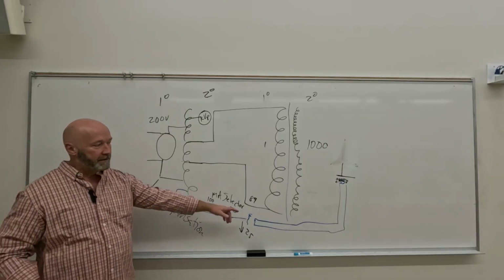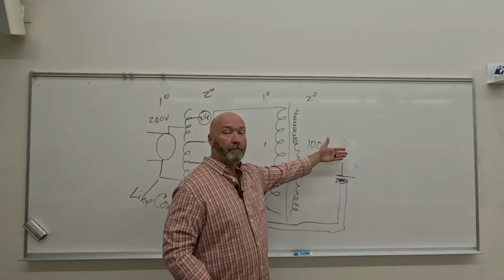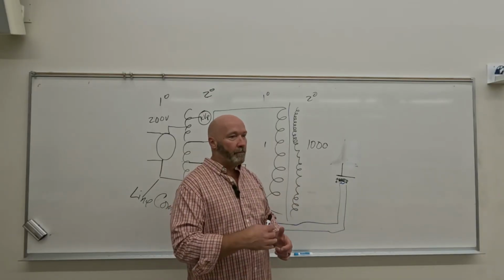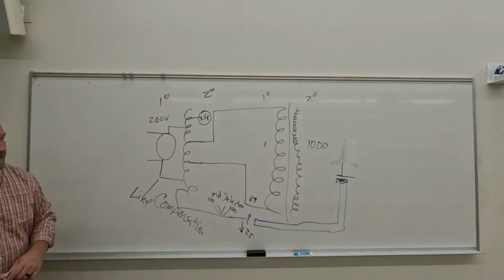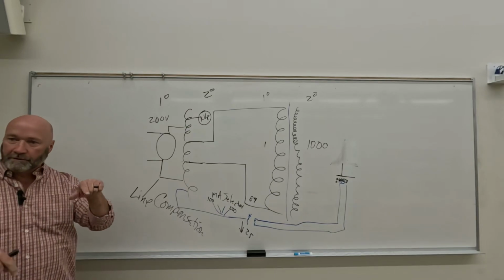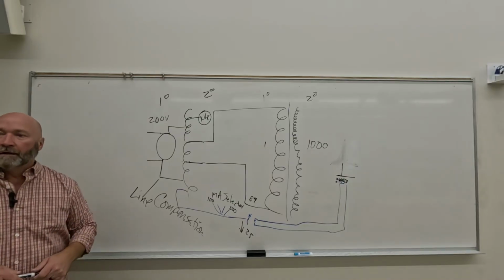But what is our purpose at this point? Is it to make X-rays? Just to heat that up, right? To the point where they're boiling off, so we create an electron cloud, thermionic emission, space charge. All mean the same thing. Okay? So we'll push our button, provided you don't go all the way through the prep button, but let's say you've got the two different buttons, one's prep, one's exposure. You push the prep button, what all happens? You get the rotor, right?